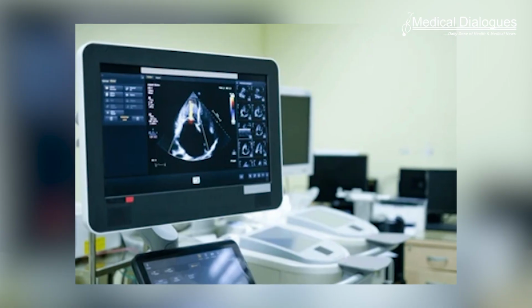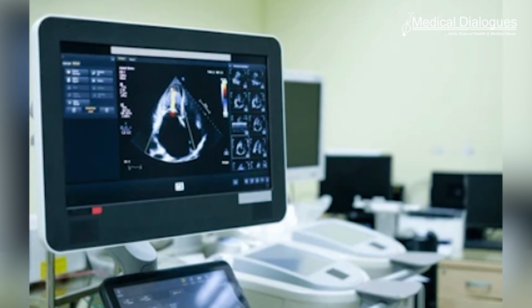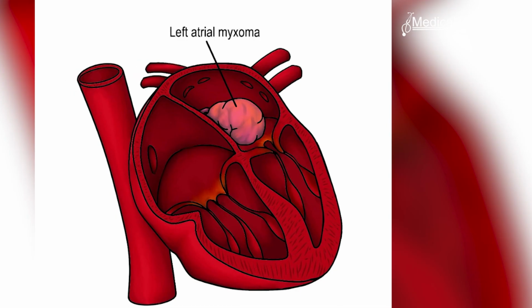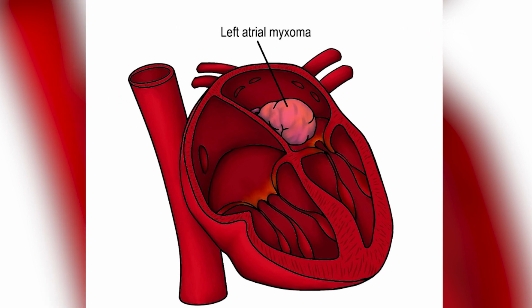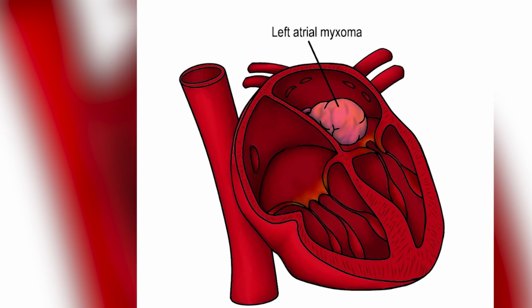Cardiac masses are a significant cause of patient morbidity and mortality by virtue of their symptoms and surgical removal. Preoperative diagnosis of a cardiac mass is usually based on clinical correlation and transthoracic echocardiography findings. Myxomas, on the other hand, are the most common benign cardiac tumors, commonly occurring in the left atrium, attached to the interatrial septum near the fossa ovalis.